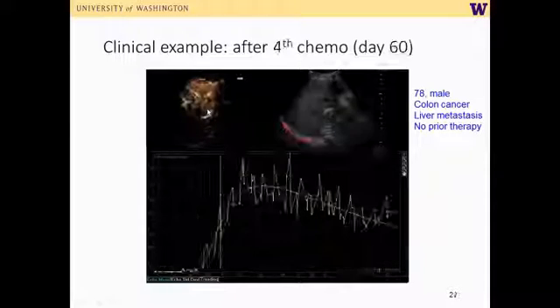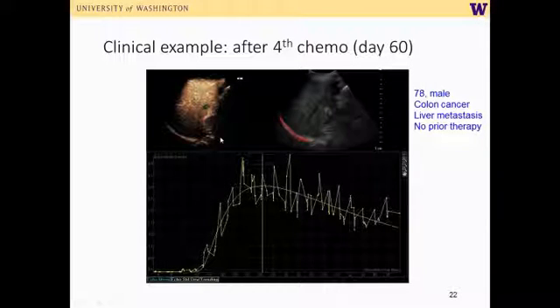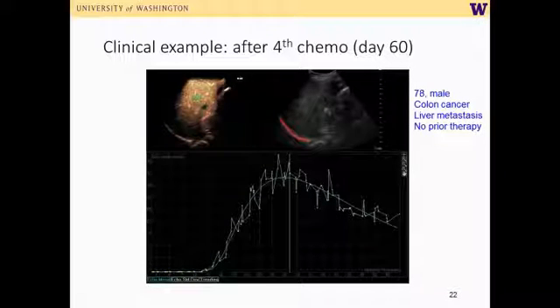And again, the same thing now on day 60, which is the 4th chemo session. And here is the tumor, here is normal parenchyma. And again, you can see how the microbubbles are washing in and washing out.